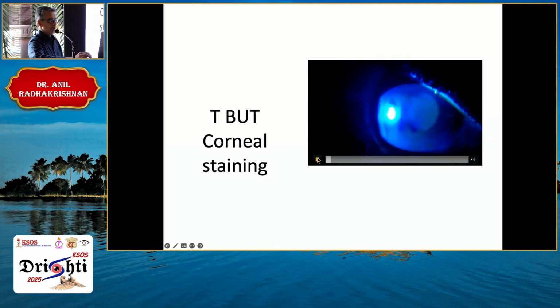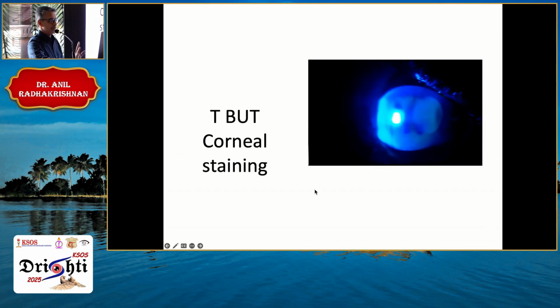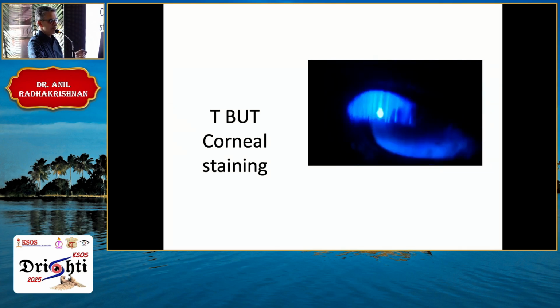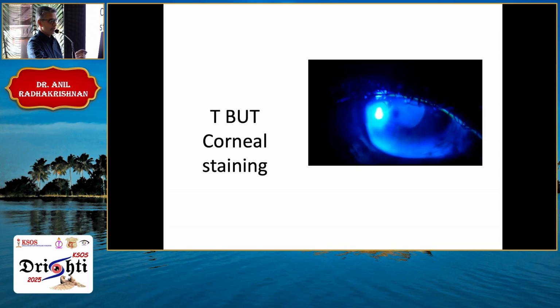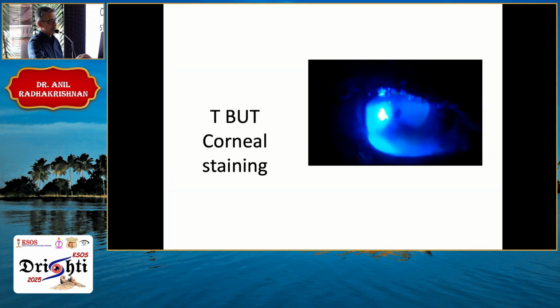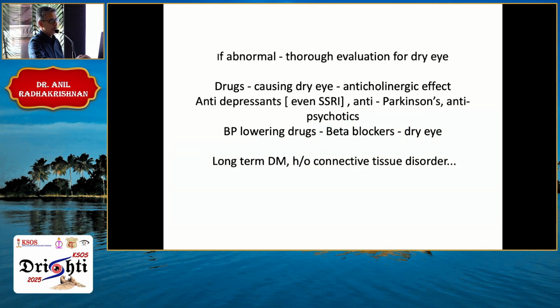Yeah. So tear breakup time, just put a drop of fluorescein and see, nothing else. You don't need any sophisticated diagnostic equipment to diagnose this. But if you see that the tear film is spontaneously breaking up, like in this patient, I don't know whether you can really appreciate. I can see it in the monitor over here. So you know that the lacrimal status is not great. So you have to tackle the dry eye properly before you take the patient for cataract surgery.